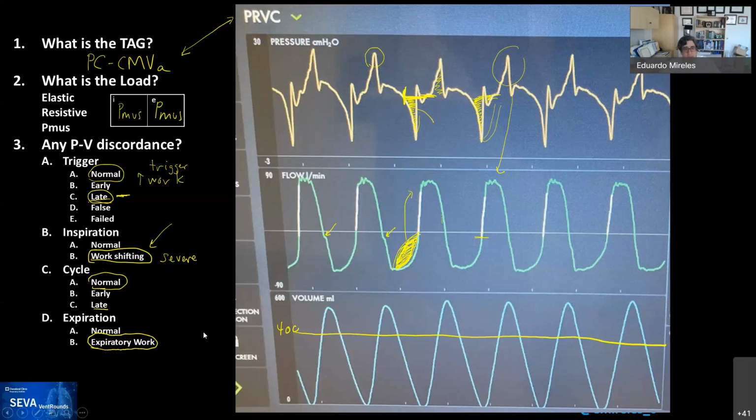I want to stop there, and then I'm going to ask a couple of questions about what to do then. What is the best alternative for these patients? So, are there any comments from the audience that want to do it?